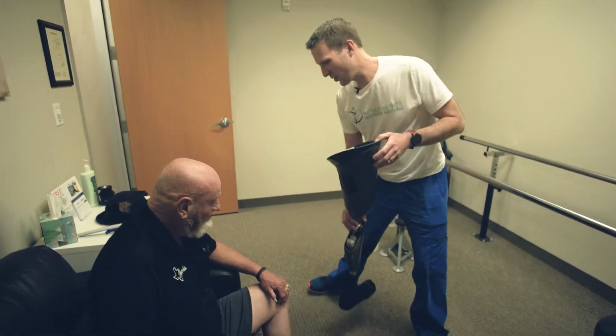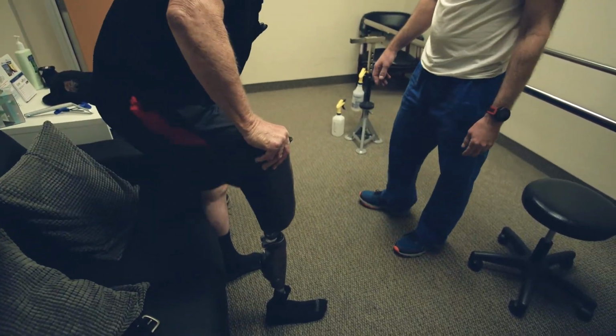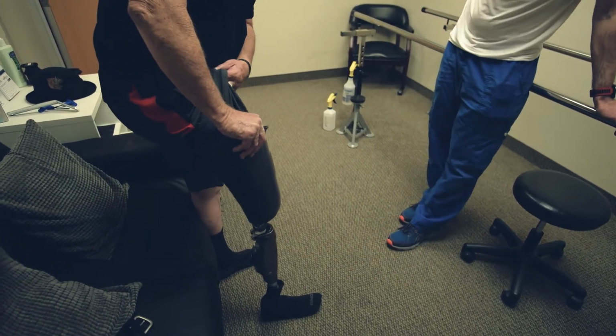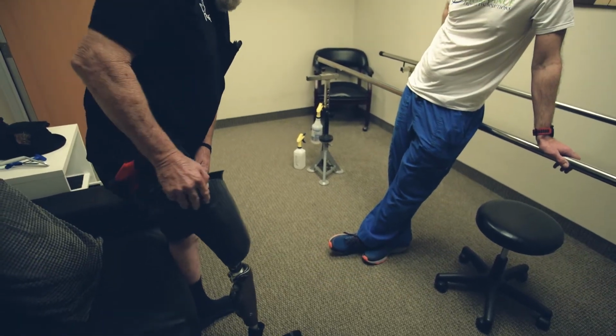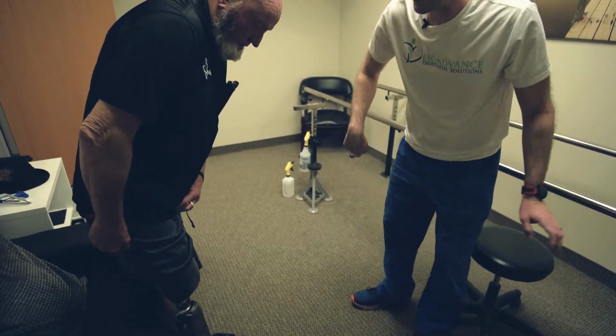Righty, let's put it back on. You don't use alcohol, do you? No. Okay, not with this system. That silicone thing, is that what it's made out of? Silicone? I think that's silicone. I think that's what you had told me. Yeah, some are silicone. They're different materials, but I'm pretty certain that's a silicone one.